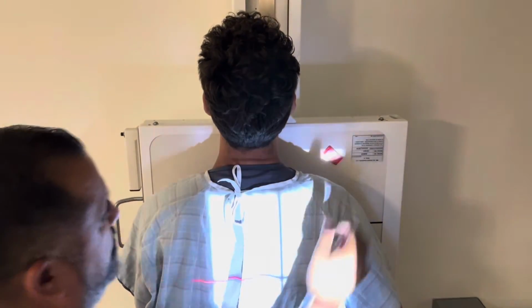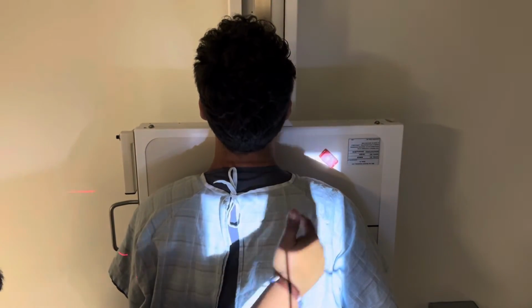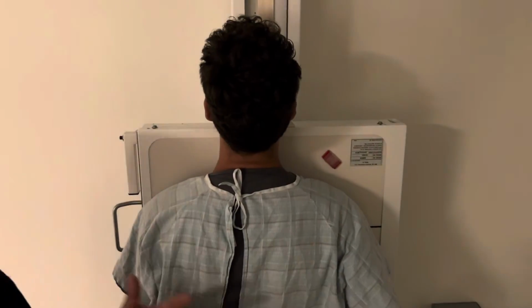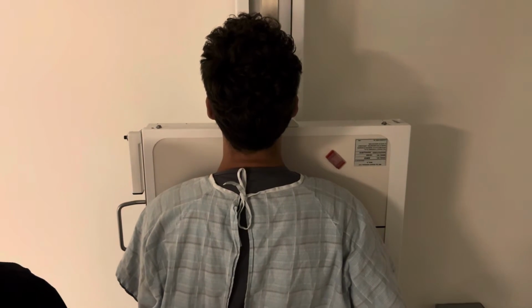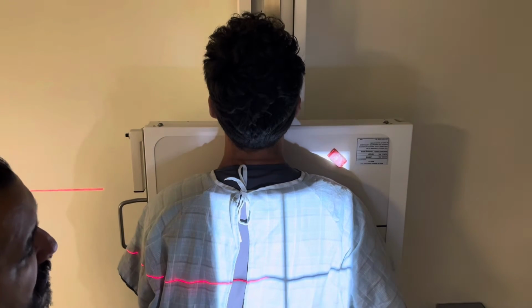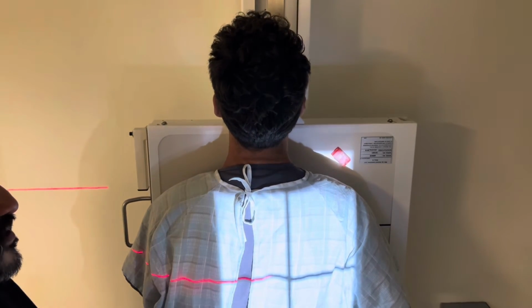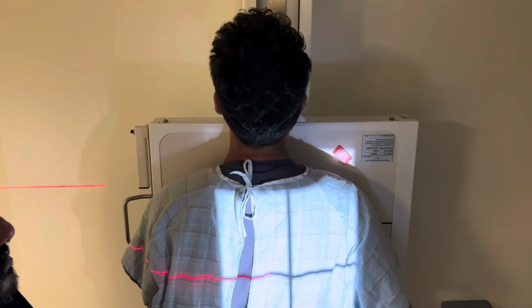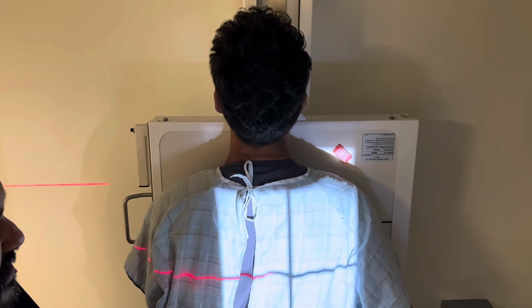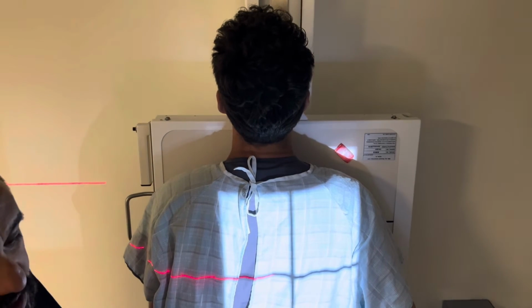Okay. So I got the right side here. I got the marker PA because he's PA, because when you look at it in anatomical position, the marker will be facing you. I just like that, just a little bit better. All right, so now again, we're going to be doing it above the diaphragm, so we want to have the patient do inspiration. So we're going to have you breathe in, let it out, breathe in again, and hold it. X-ray clear, beep.